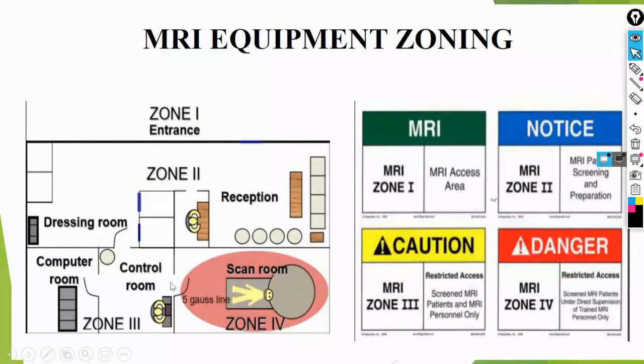Sometimes, even the door itself can have a connection to the frame, so when the patient enters, it can indicate that there is metal on them. This is more common with external items rather than internal ones. If something is inside, the detector won't beep. The ferromagnetic detector is only for external items, not internal ones. For internal items, you need to inform the doctor.